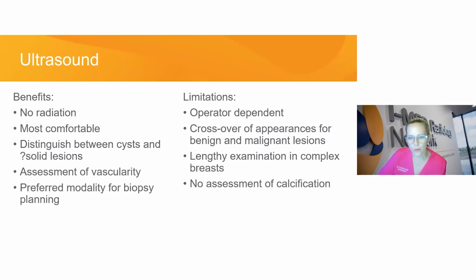Our limitations are it's very operator dependent. So we have wonderful breast sonographers, and that's all they do, or general sonographers who do whole days of breasts and are highly trained. And then there's other sonographers who have not had that level of experience and maybe overcall or have more trouble distinguishing between benign and malignant findings, because there is a crossover. So there are many benign lesions that appear very nasty on ultrasound, and we have to do the biopsy and find out what they are. And similarly, every now and then you get caught out by something you think is quite benign on ultrasound and it turns out to be a malignancy.